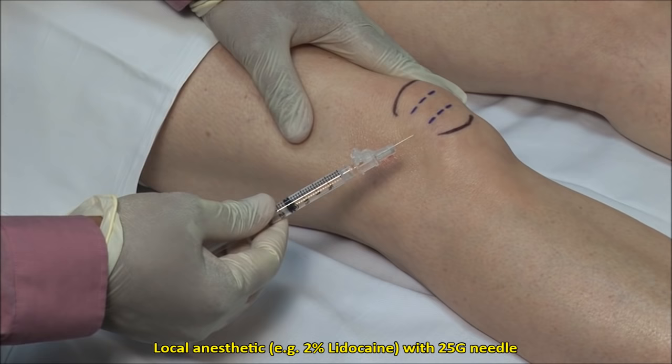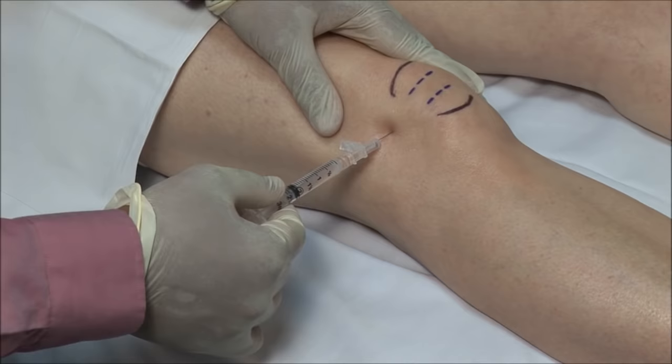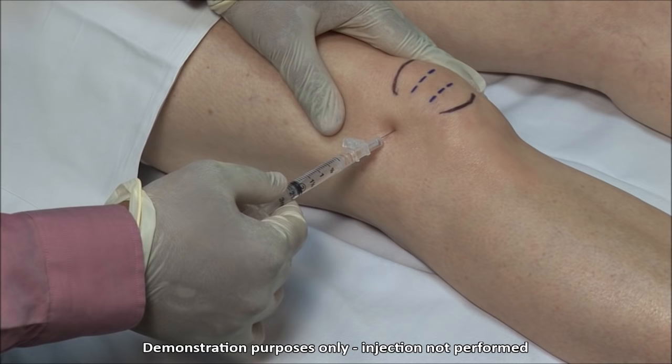Local anesthetic can be applied to the skin and subcutaneous tissue down to the joint capsule using a 25 gauge needle, but experienced clinicians may forego this. If you anticipate difficulty or expect to aspirate fluid, which would mean a longer procedure, then you should use local anesthetic first.